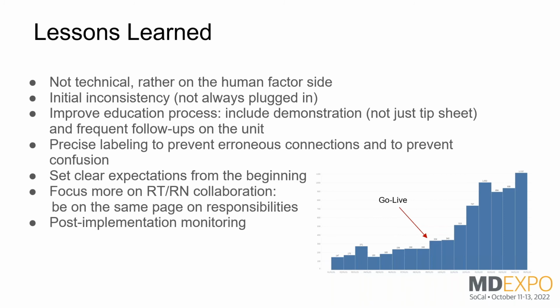On our side, remember that we decided initially to keep the med device label as is. It turned out that could be not very clear, especially for travelers or temporary staff, who, not seeing a specific label, get confused. So we reevaluated the use of the nurse call 2-jack station and decided to label it Bipap, dedicating one of the 2 ports to Bipaps. We did that physical relabeling, but we also mirrored it in the software, so that on the nurse call station, the white phone, they would read Bipap, and on the phone the label would be the same, consistent.